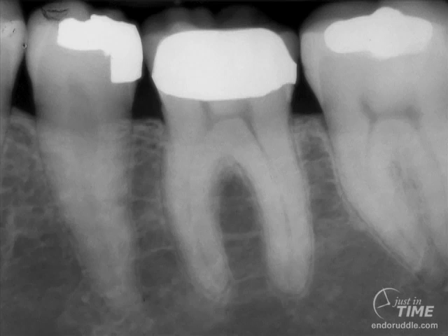Notice this first molar has a clinical crown on it, porcelain fused to metal. Notice the pulpal roof and floor are quite close in proximity. You can see the horns emanating up towards the occlusal table, and they disappear under the restorative. Importantly, notice the entry angle of the coronal 1/3 of the mesial systems into the pulp chamber. Note that awkward curvature into the chamber. The crown will be removed, but first let's just review the sequence.